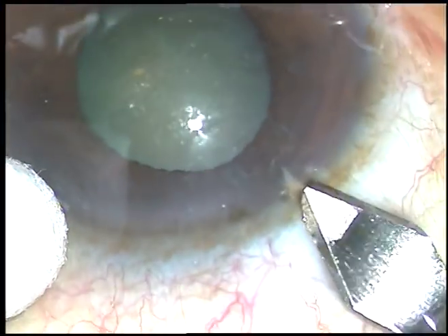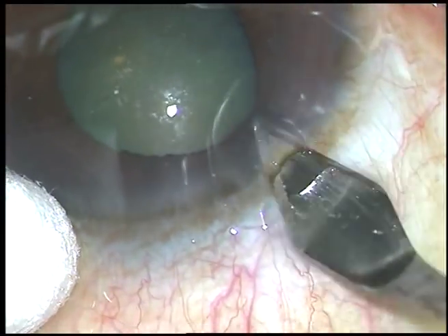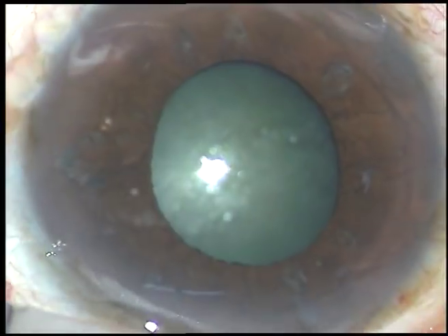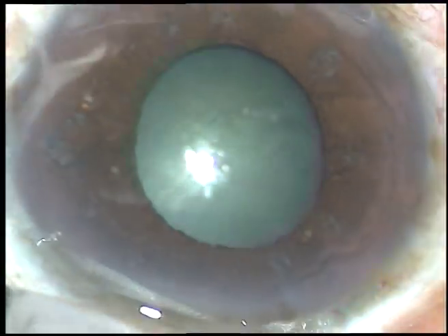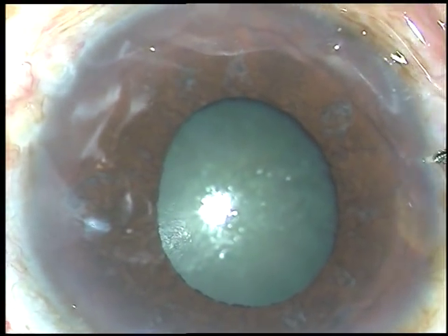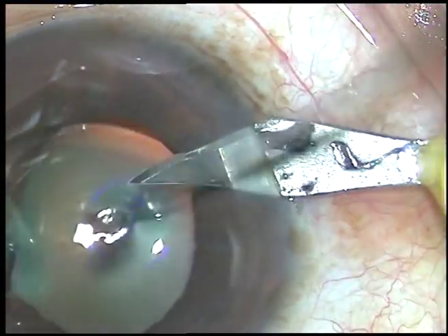Dear colleagues, this patient is having a cataract with a small pupil and I have to do this surgery under topical anesthesia because the patient is too apprehensive to take a peribulbar injection. This is an unedited recording so you are not going to miss anything.